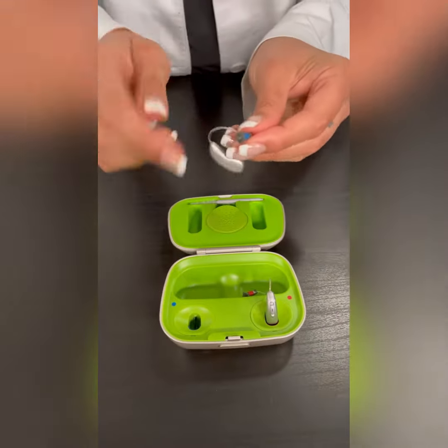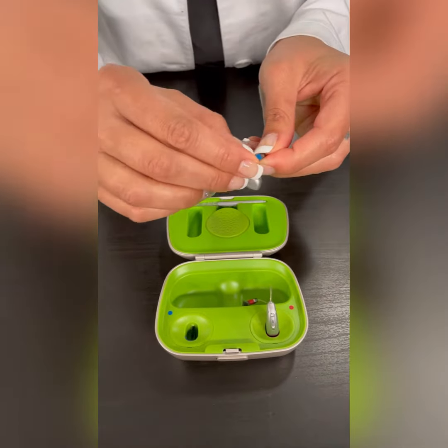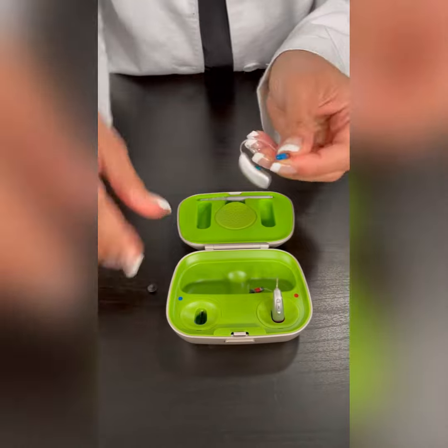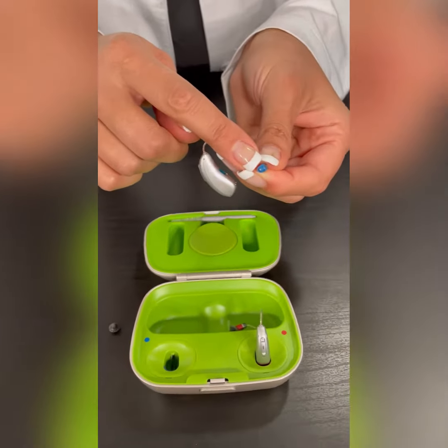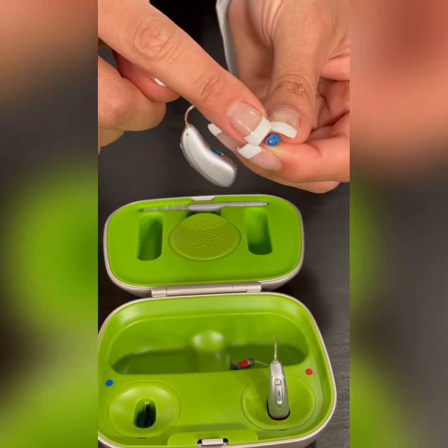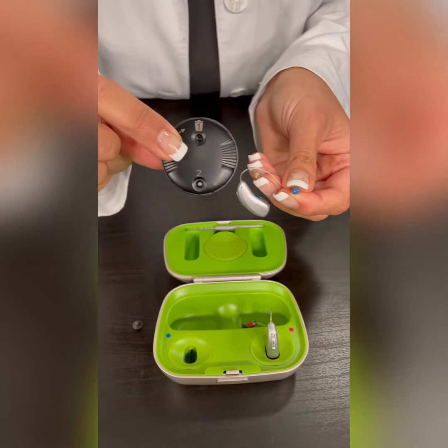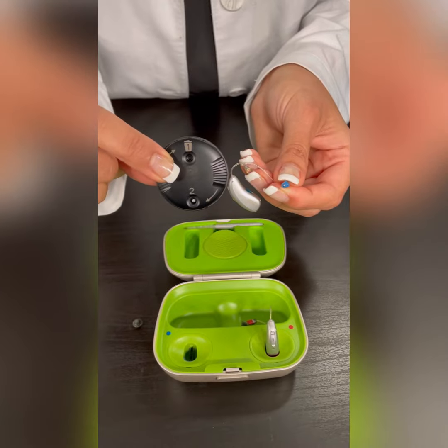All right, well, we're going to start by removing the plastic dome. You'll just want to give it a tug. It's plastic, so no worries on damaging it. You have your filter here. It's very small, so no worries if you don't see it. You have your disc. Number 1 and number 2 are labeled.